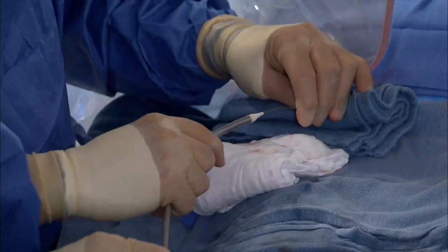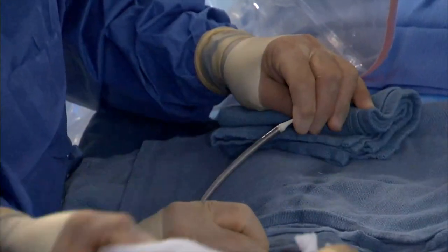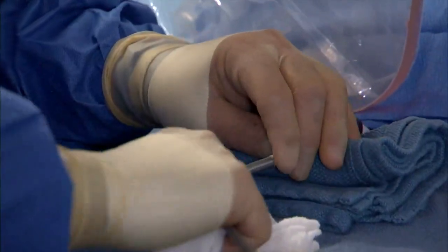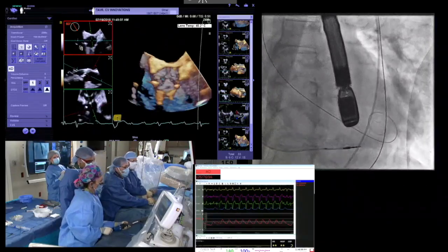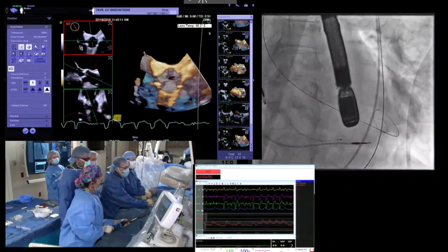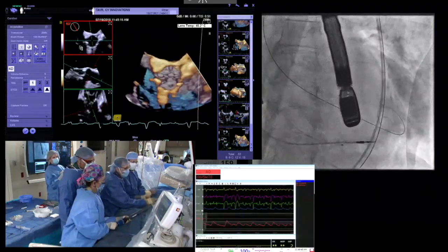Okay. And to answer Dr. O'Neill's question, we BAV 100% of our LOTUS valves. Yeah, I don't really see a reason not to. I think it's just you don't want to regret it. Especially in really heavily calcified valves, it would be worthwhile doing. BAV regret is something that Dr. Reisig is always afraid of.